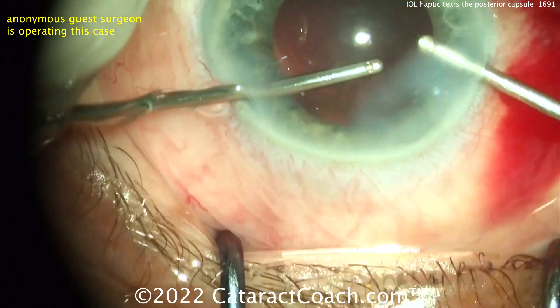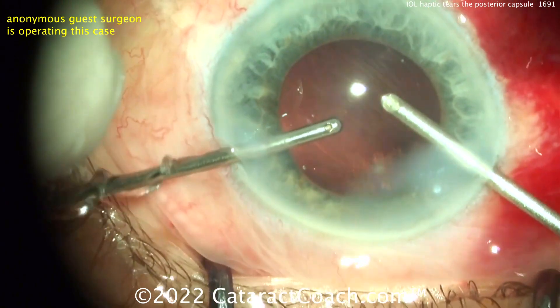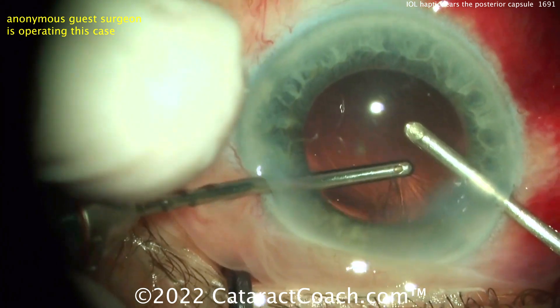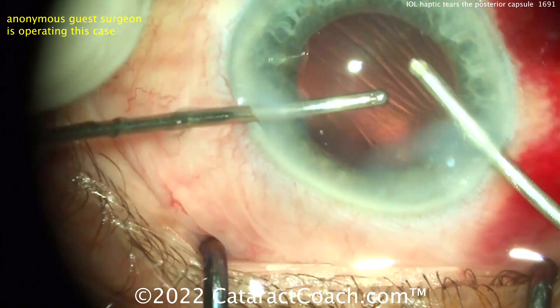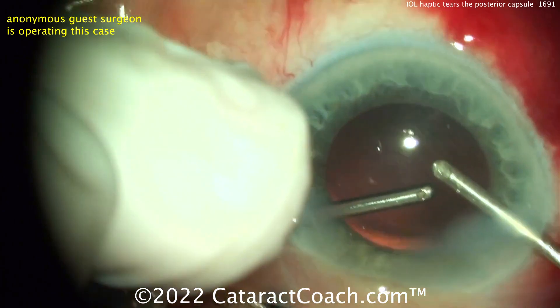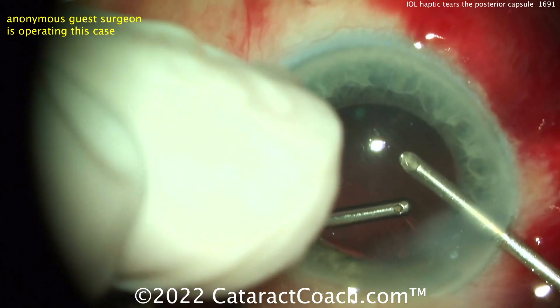Remember, three-piece IOLs have haptics that are different from a single-piece IOL. They're thinner, and that's how we're allowed to place them in the sulcus — because they are so thin. But because they're so thin, they can also easily poke and penetrate the posterior capsule.